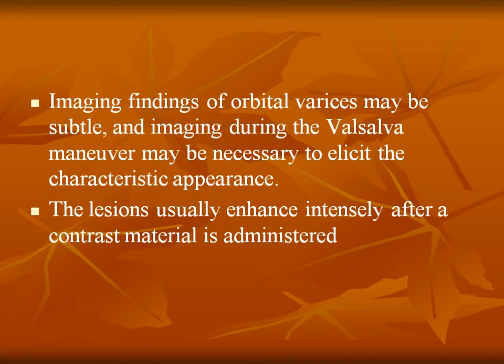The imaging findings may be subtle. Imaging during Valsalva maneuver may be necessary. Sometimes you have the patient perform the Valsalva maneuver and do the imaging to see the exophthalmos and the engorgement of the varices, like varices anywhere, like scrotal varices or lower limb varices. With Valsalva maneuver, they will distend.